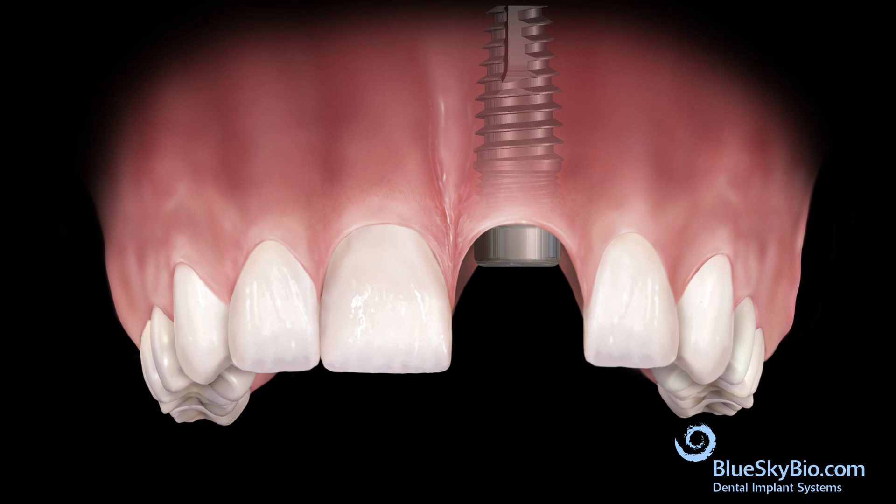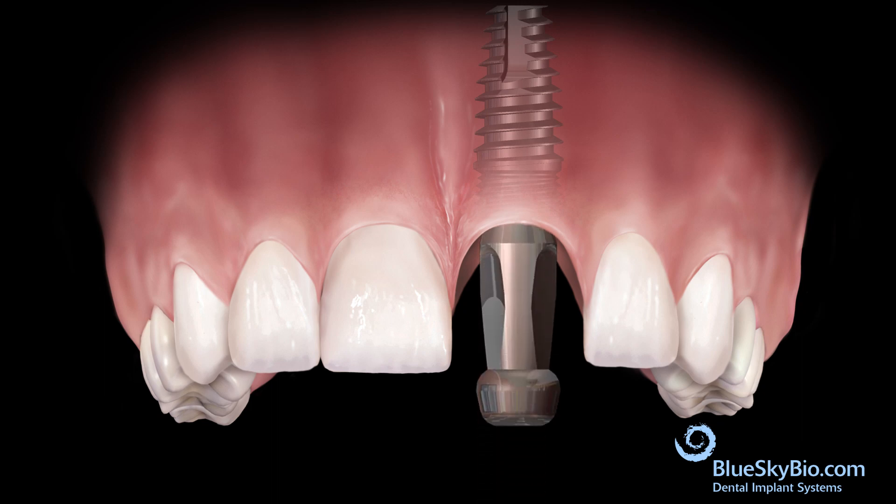After the implant is adequately integrated, remove the healing abutment. Insert the impression transfer. It is important that the mating area of the impression transfer fully engages the mating area of the implant. Tighten the fixation screw only with finger pressure. Fill the top of the screw head with wax to prevent impression material from flowing into the head of the screw.